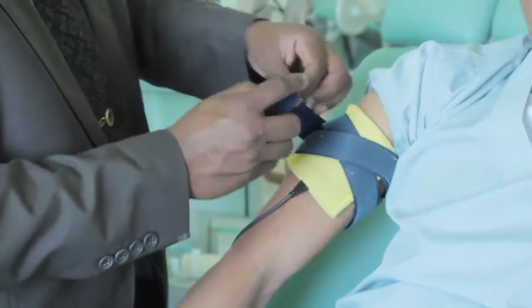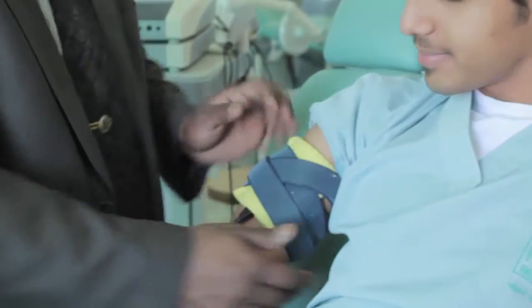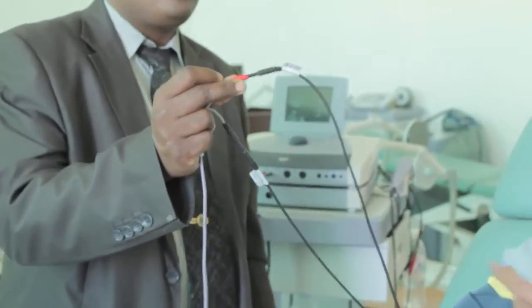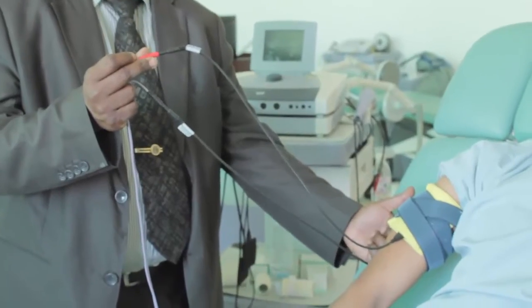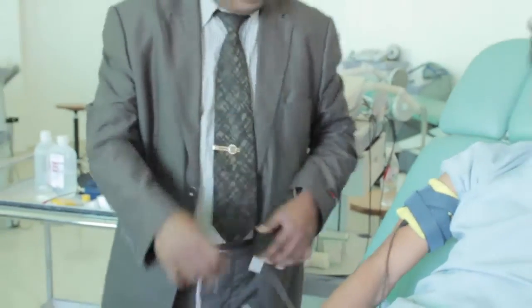So this is anode. So anode on the pain, red anode on the pain, opposite cathode, is a completing electrode. It will complete the circuit.